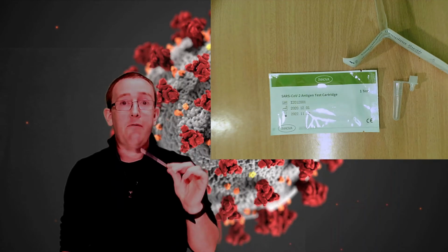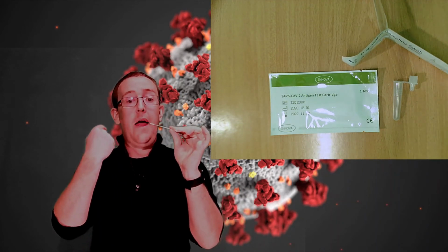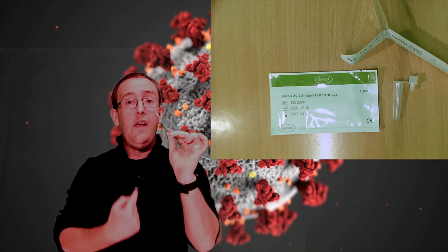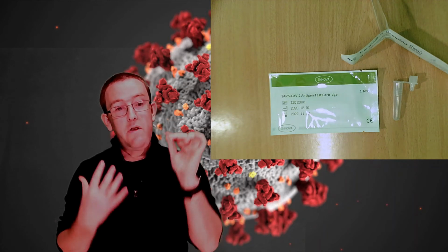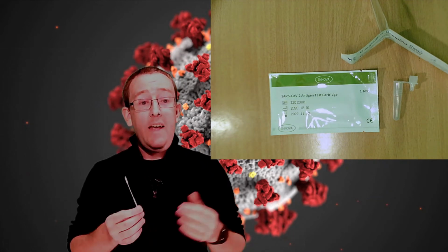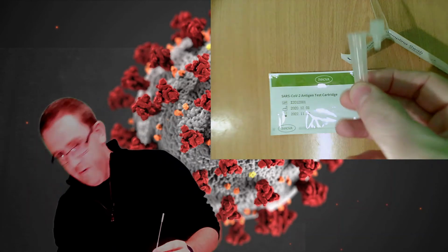not to the point where it's in their lungs, it doesn't need to be that far, but over the teeth and over the tongue, don't touch those, onto the tonsils at the back, 10 seconds on one side, rub, 10 seconds on the other side, rub. Then taking that out and putting it into the nostril, and again, we're pushing it back into the nostril by a few centimetres, but not so many that it hurts, of course, and we're not looking for people to cause themselves nosebleeds. And that comes out, and that's where we get to this little bit of equipment here.